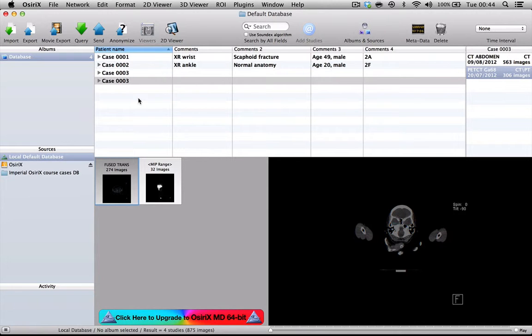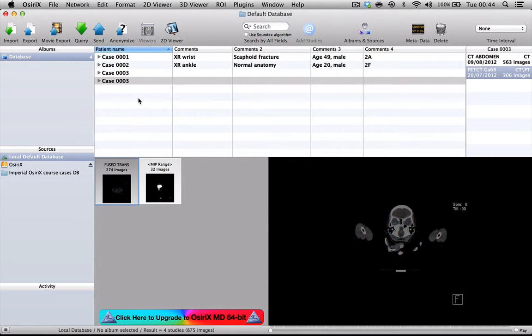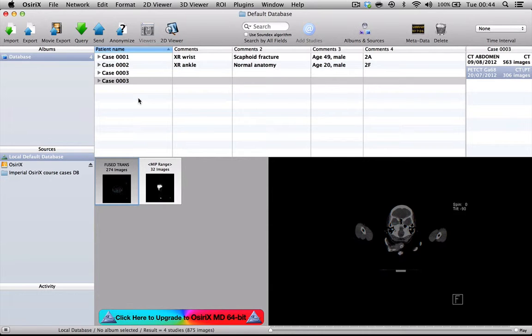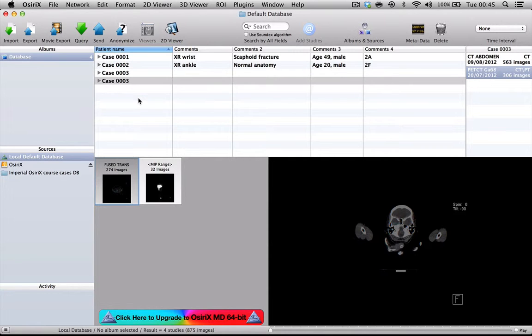I've shown you two ways of anonymizing patients, one using the anonymized tool within OsiriX and the other simply editing the DICOM headers. I've mentioned to you that there is an alternative method using software called DICOM Cleaner that you can learn about in another video tutorial. I hope you've found that helpful. Thank you for your attention.